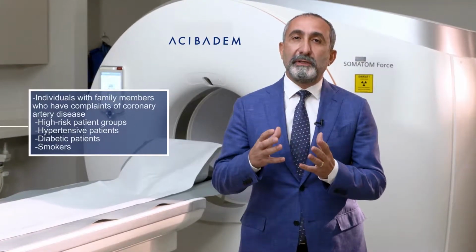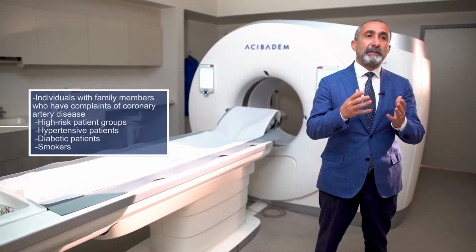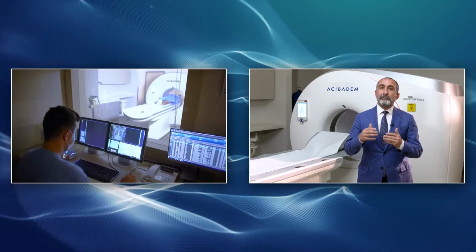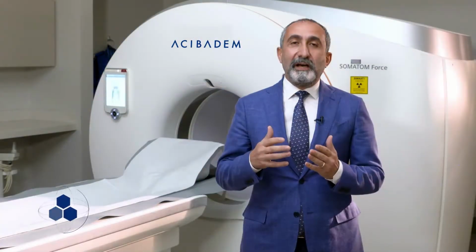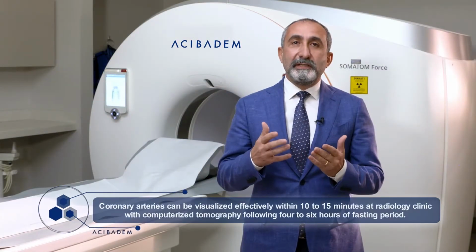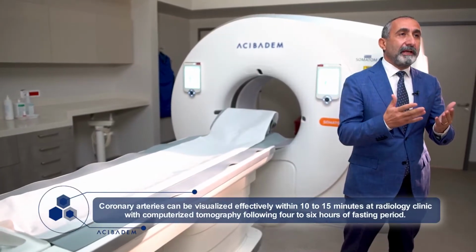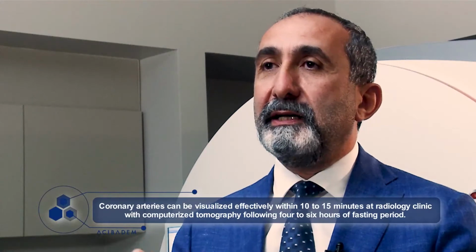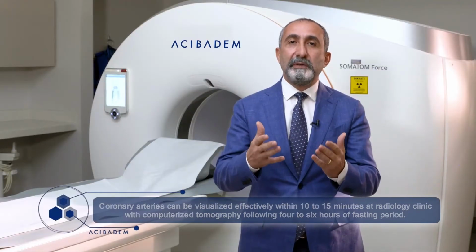Computerized tomography is the easiest and most effective imaging modality to visualize the coronary arteries for people with family history, notable complaints related to coronary artery diseases, high-risk patient groups, hypertensive individuals, diabetics, and smokers. Coronary arteries can be visualized effectively within 10 to 15 minutes at radiology clinics with computerized tomography following 4 to 6 hours of fasting.